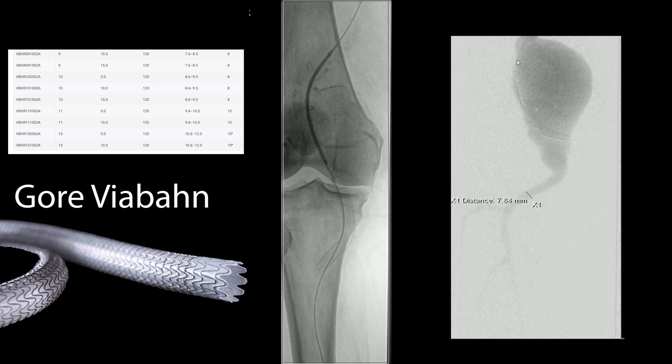You start by crossing the lesion. Here you can see the first viabond — I believe it was a 10 or 11 — being put in distally and deployed. Then we put in an intermediate one to build up the entire length. Here we see a viabond being deployed inside another viabond; you need at least a couple of centimeters of overlap, ideally more.